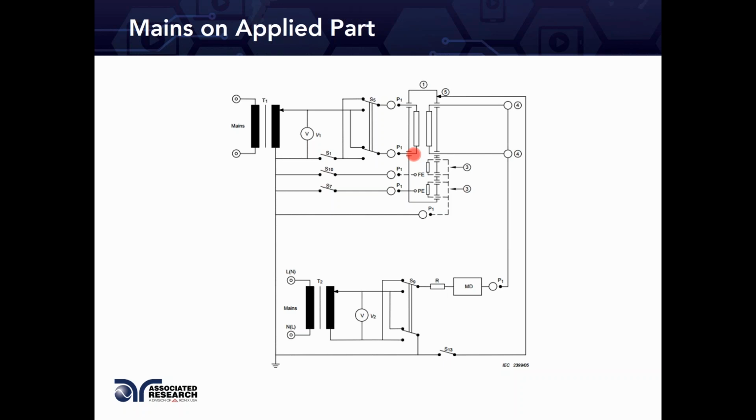If you have an F-type requirement, these are additional isolation, and you have to be able to prove that this additional isolation exists, not only during prototyping phases, but also during production. Are you checking this during your production? Is the isolation that was designed to be there still there when the unit is being produced?